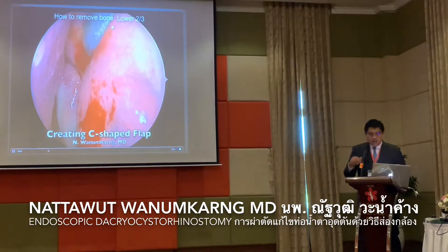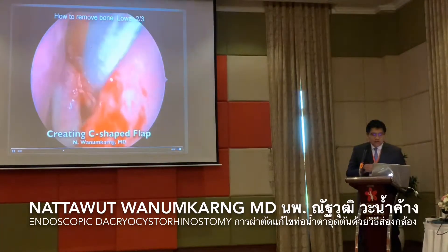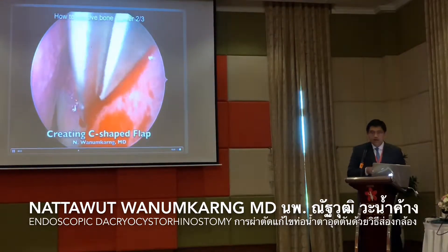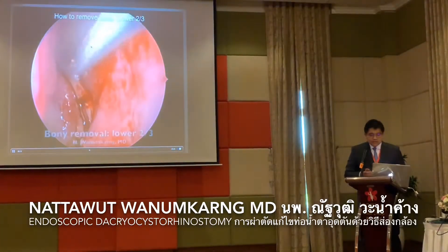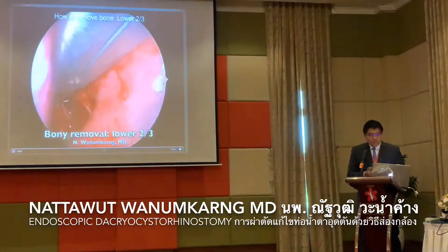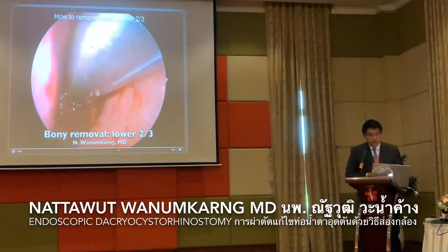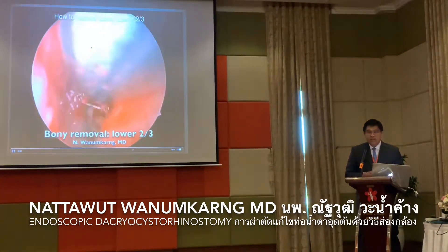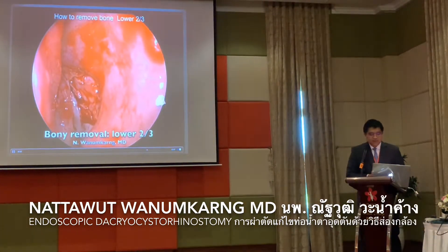The first step is the lower two-thirds, and the second step is the upper one-third. When we open the nasal mucosa, we cut and create the C-shaped flap. This is a simple approach. Then we use a simple Kerrison rongeur to remove the lower two-thirds of the bone. This part is not that difficult because we have good access and enough space to work.